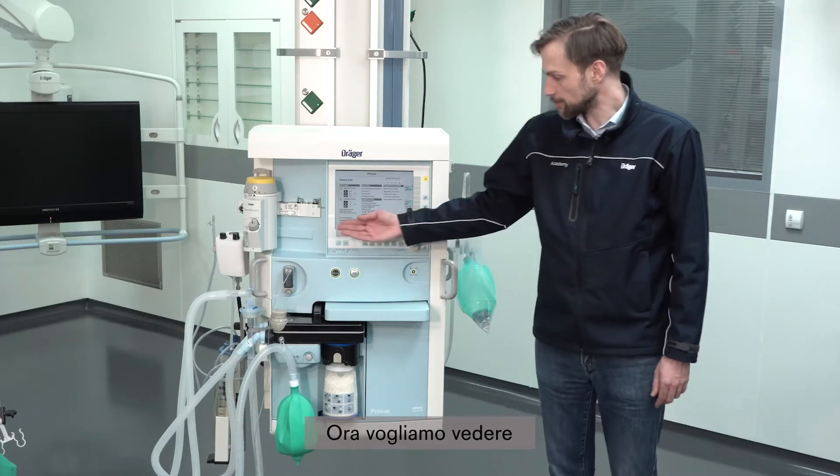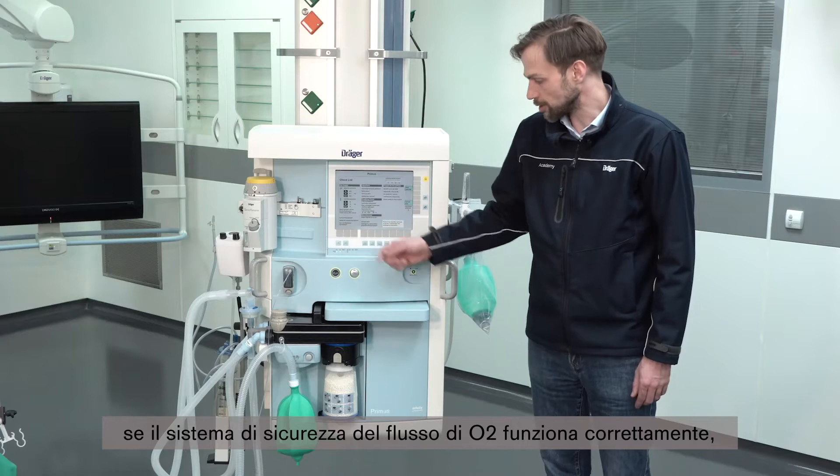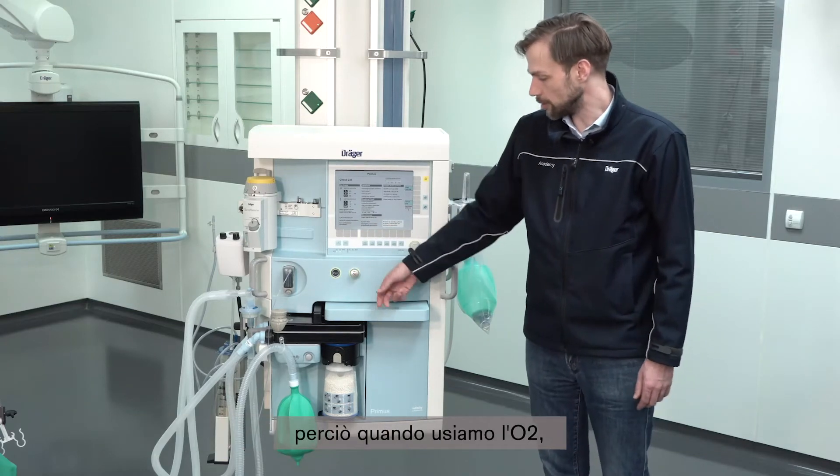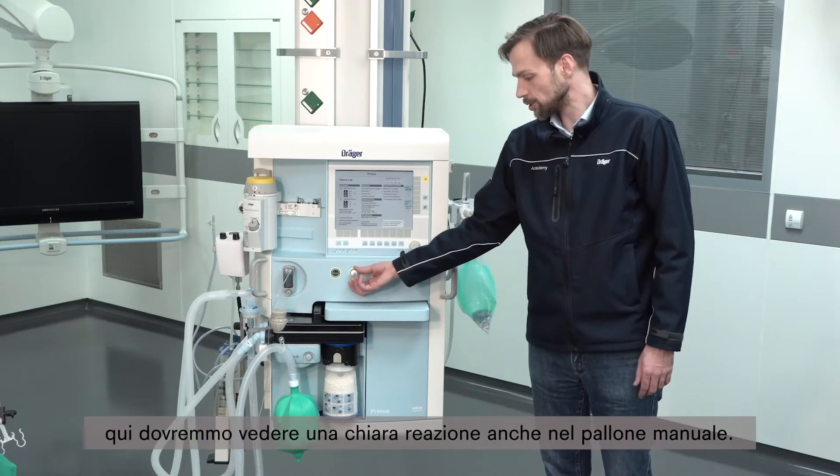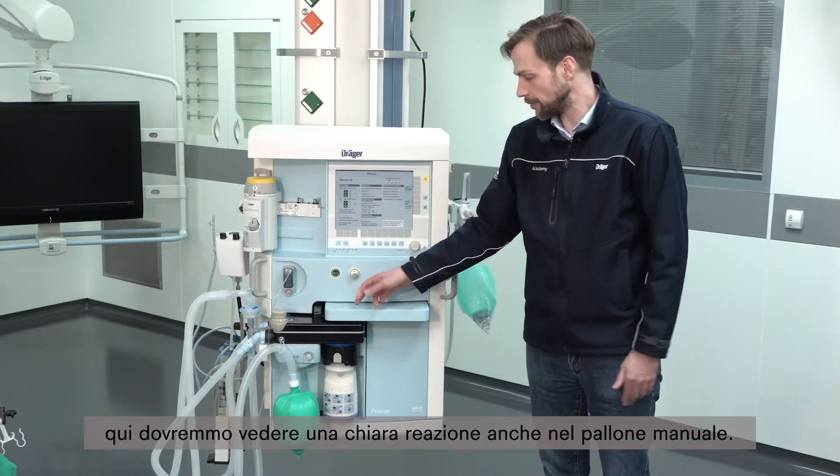Next we would like to see if the safety O2 control function is properly working. When we use the O2 knob, we should see a clear reaction as well in the handbag.